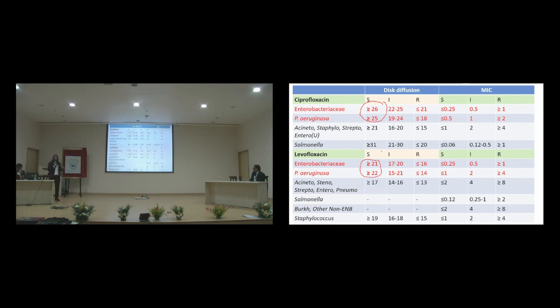Why is it important to be aware of these changes? Especially for people who are using Vitek, only Vitek, or even for distribution. How many of you are using Vitek? Many of you. You know that Vitek has not changed from 2018 to 2019. When we asked them, they told us they will change only in the month of April. So, sir, how to address this?